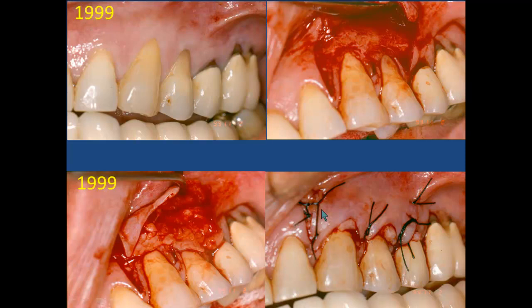The flap, vertical sutures, and the papillary sutures were included in the graft from the sides and from the middle interproximally to provide stabilization of the graft and avoid mobility that could endanger the anastomosis of the blood supply of the graft.